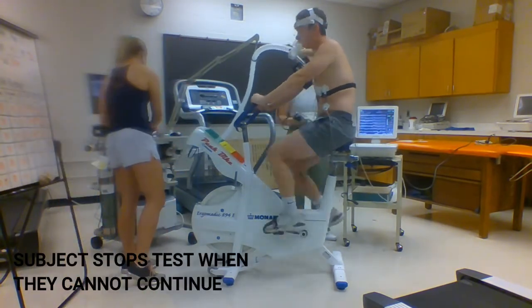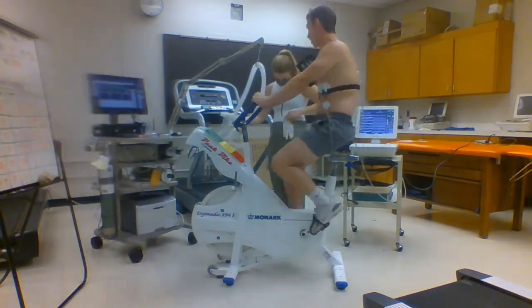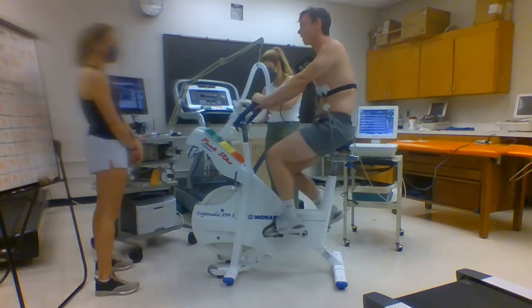Once the test is completed, remove the one-way valve and have the subject continue to pedal at a slow pace with no resistance until they feel somewhat recovered. The maximal exercise test should take approximately 8 to 12 minutes. It is important to have someone continually evaluating the ECG recording for any changes. If certain ECG abnormalities are observed, this would be cause to terminate the exercise test immediately.